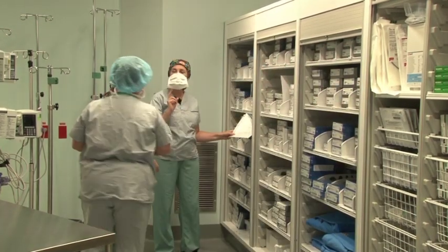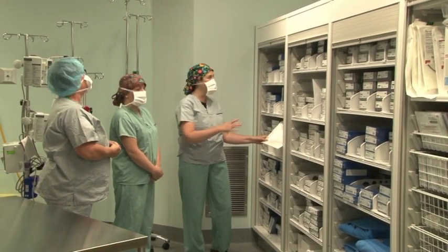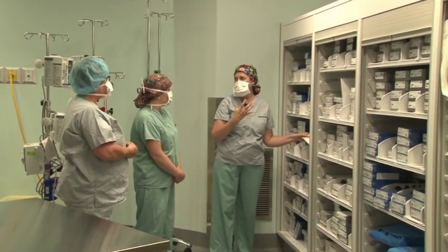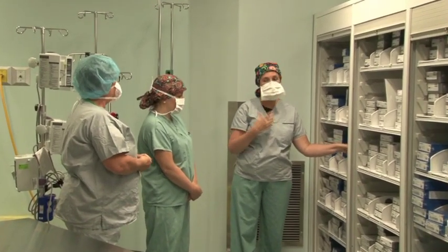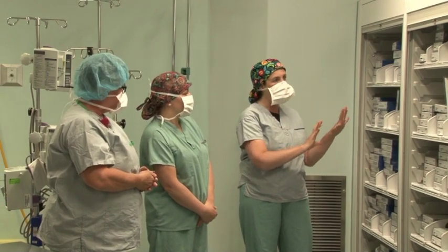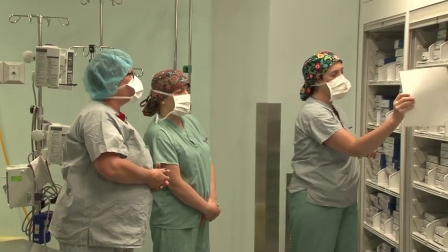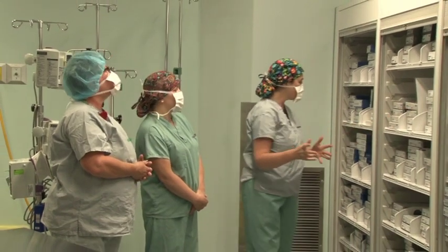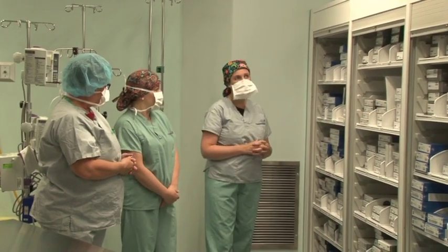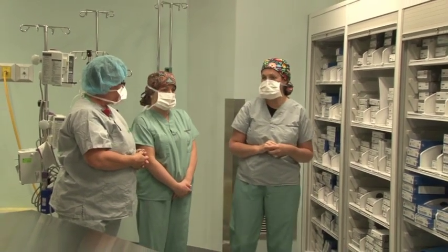But we try to always have two nurses come over together, or the physician and the nurse come over together, two sets of eyes, to make your decision on what we're pulling out. Or if the reps are here from the companies in regards to the ICDs, they'll stand there with us and help to figure it out. St. Jude has a nice laminated sheet, Medtronic too, and we have pacemaker information there. So two sets of eyes and make your decision.